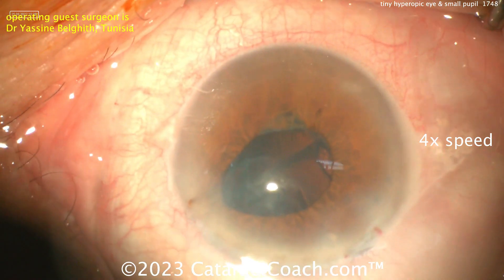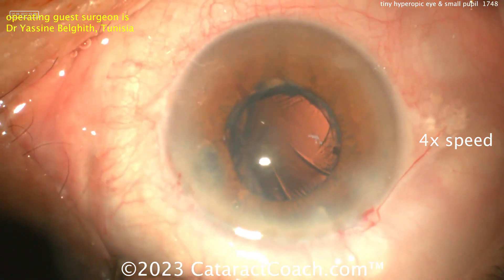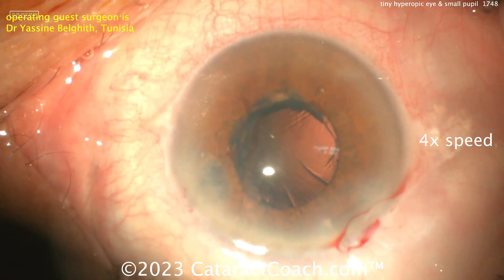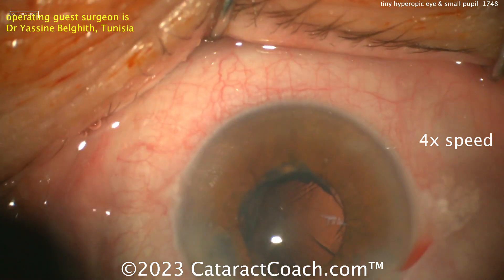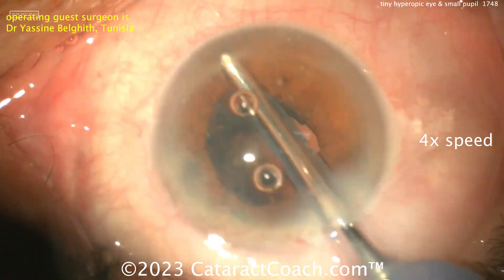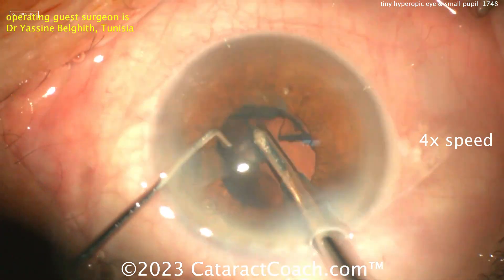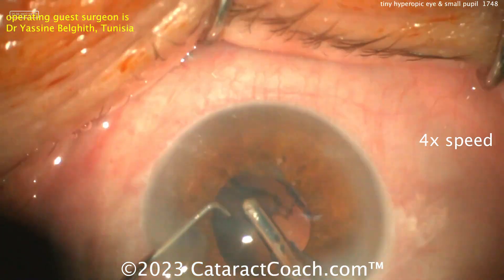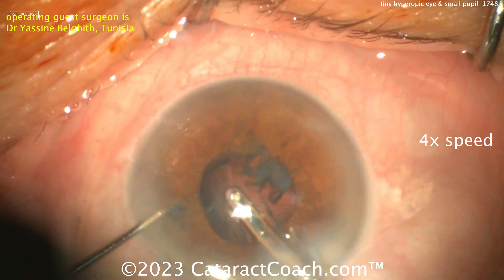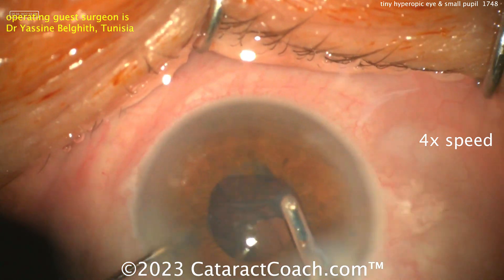So tough case — I don't enjoy doing these high hyperopic eyes, it's just stressful. More viscoelastic added, which is a smart move. You can see where the iris wanted to prolapse out the paracentesis, there is already some atrophy of the iris there. These ultra-high hyperopes, with very shallow anterior chambers, tiny eyes, nanophthalmic eyes — those are my least favorite eyes. They just give you stress.